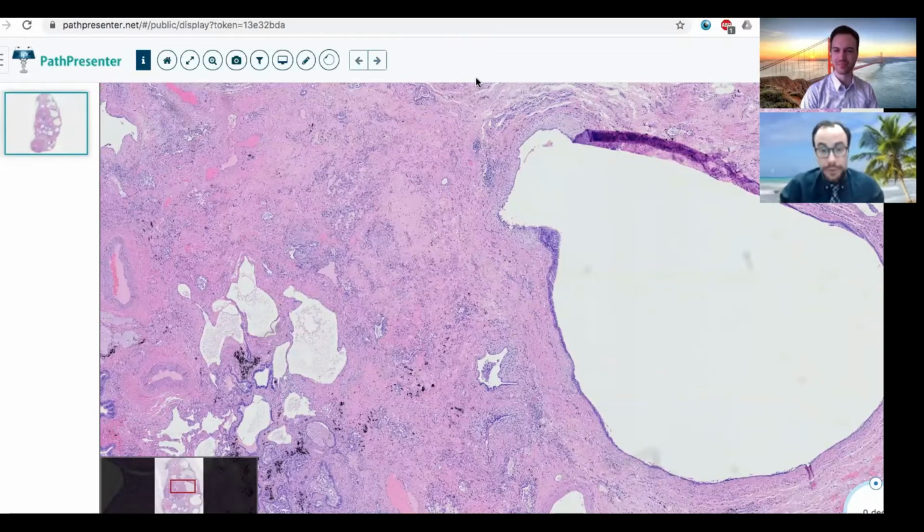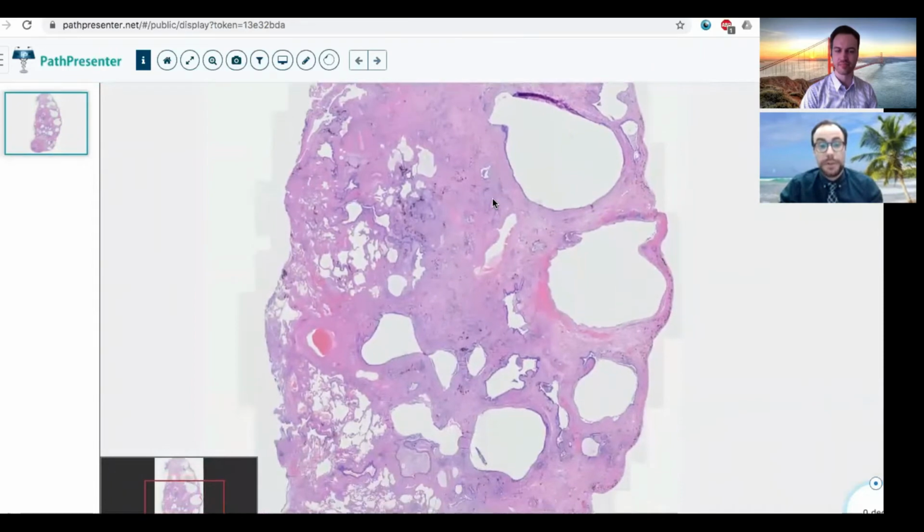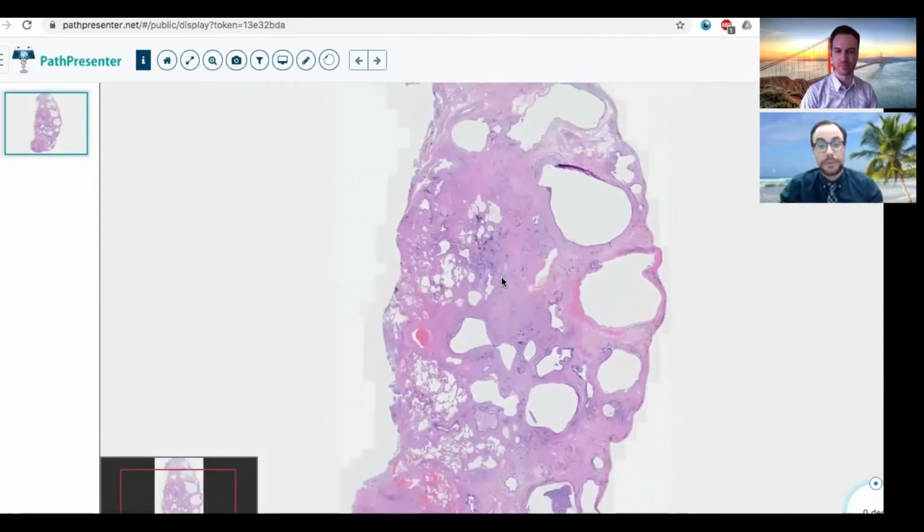Great. So thanks for joining and thanks for reviewing the case. Maybe we can go over this first case that we have here. Maybe you can start with describing your findings at low power.